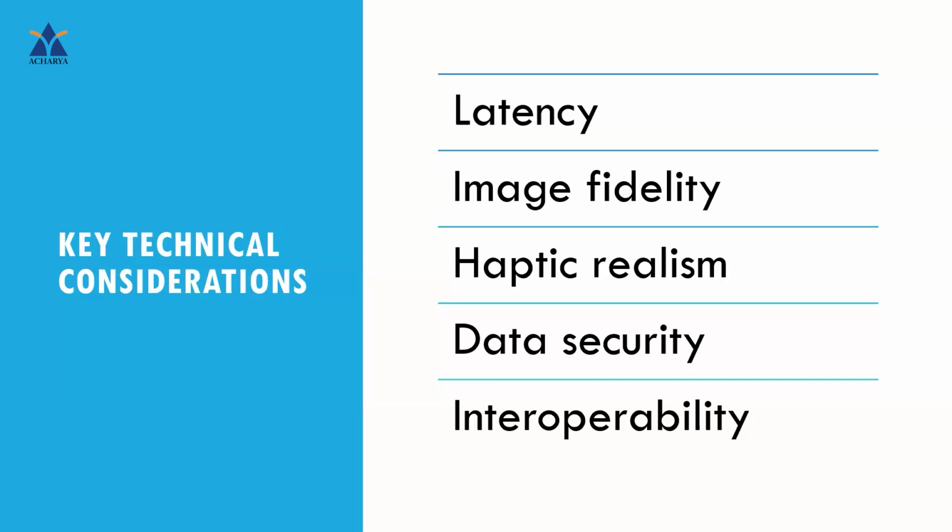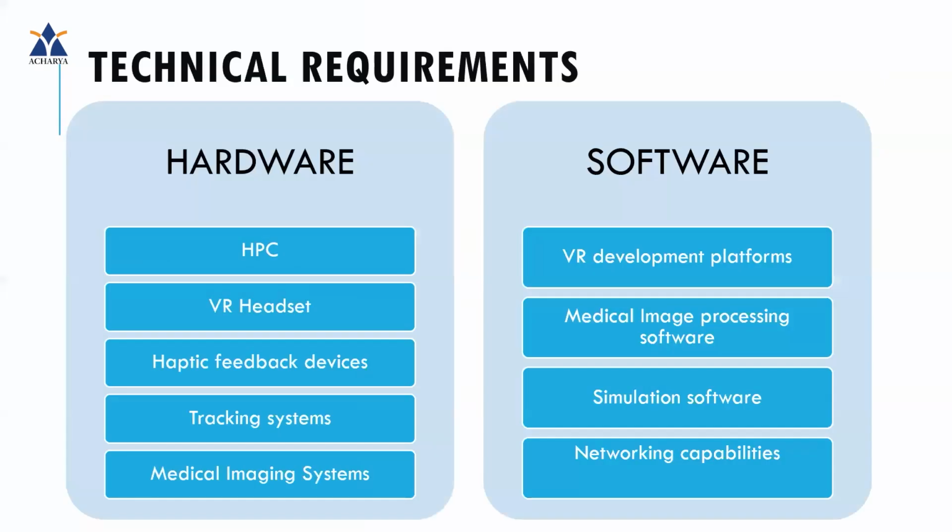And then interoperability. So you have to ensure compatibility between different hardware and software components so that you can use it in a better manner. And it has to be integrated with your existing hospital information system so that different devices can be used.